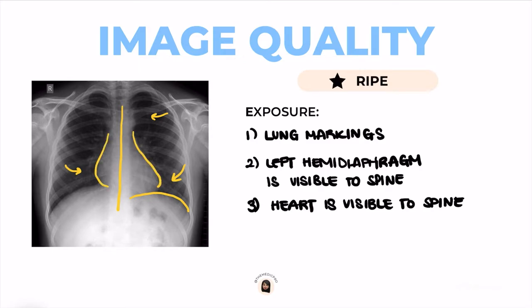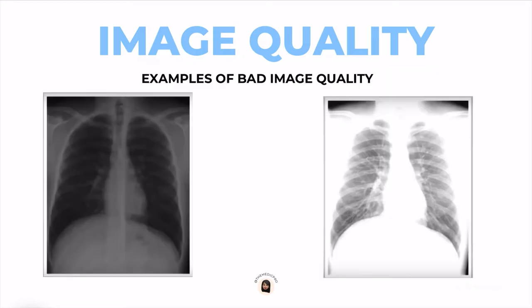Now that we've checked the image quality, we can move on to the x-ray interpretation. Here are two examples of what bad image quality looks like. The image on the left shows low exposure, and the image on the right shows high exposure. We can clearly see that you cannot differentiate the spine from behind the heart, and you can't even see the lung borders clearly.